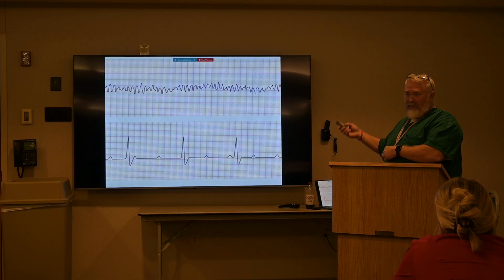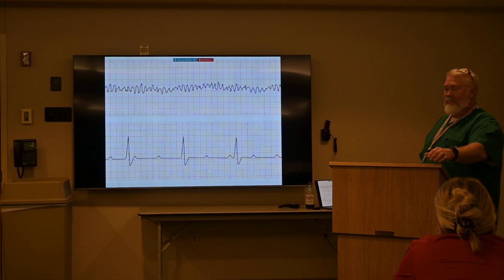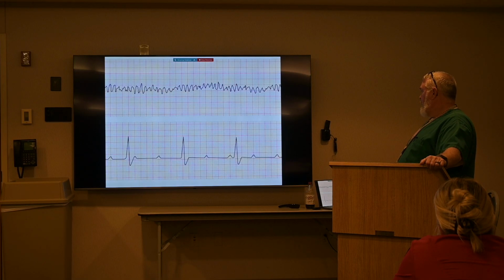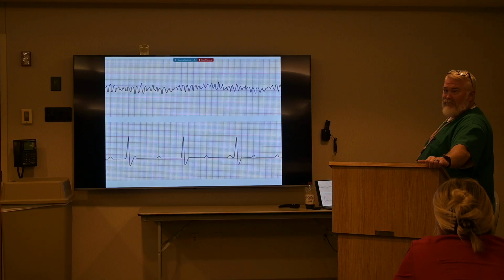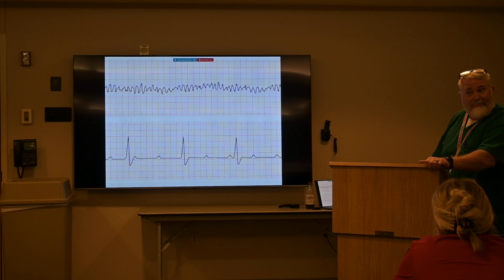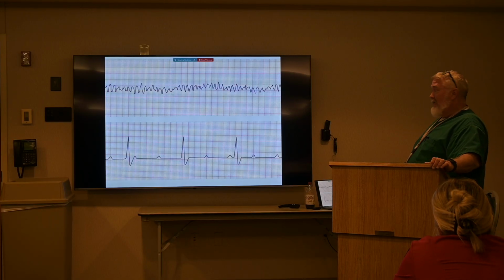So this person probably is going to need a pacemaker, most likely. Medication is not going to fix this. Get him out of here. Yes, this would be get them out. Yes, we can put on a transcutaneous pacer, but they will not like us. Especially if you have to turn the milliamps up pretty high. So you will want to sedate them if they will tolerate it.